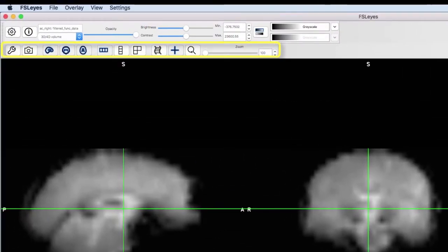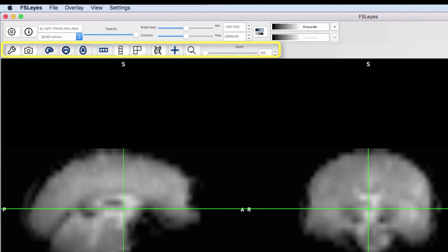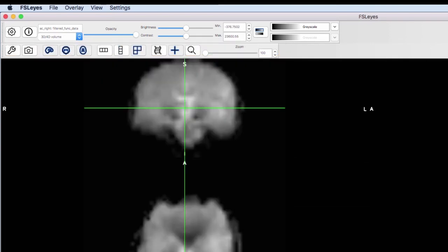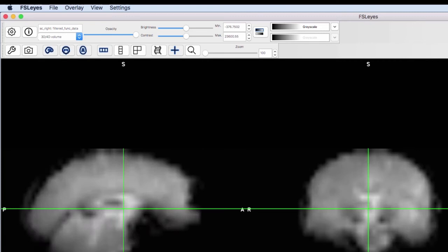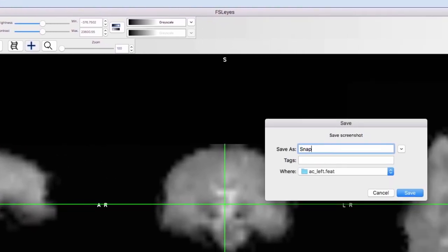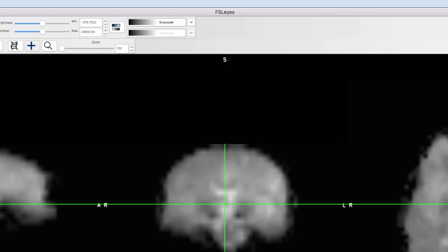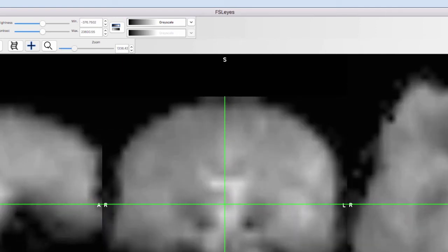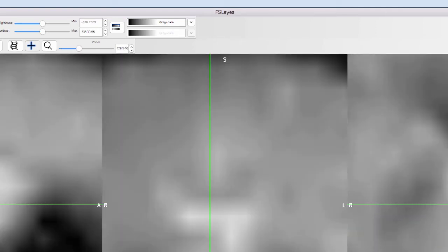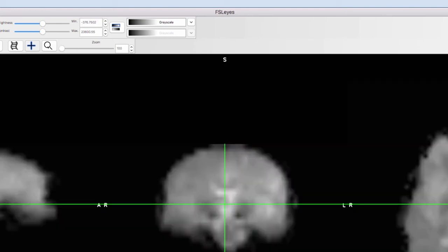The Display Toolbar controls how the image is displayed. For example, you can change the layout and add or remove canvases. You can also take a snapshot of what is displayed in the viewer. You can zoom with the slider, or click and drag the right mouse button to zoom in on a certain region. If you want to restore the zoom to its original setting, press the magnifying glass button.